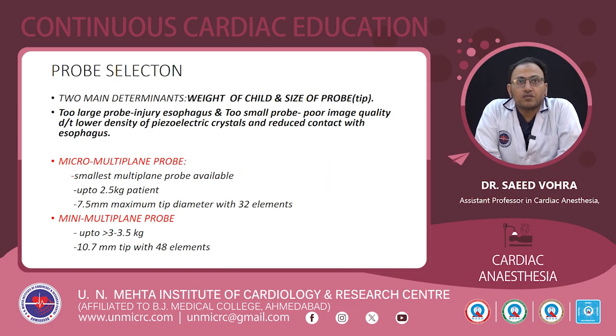Coming to the probe selection, there are two main determinants while selecting the probe: the weight of the child and the size of the TE probe, especially the size of the tip. If the probe is too large, it can cause injury, esophagitis and oropharyngeal injury. If the probe is too small, then poor image quality can occur due to the lower density of piezoelectric crystals and also due to reduced contact with the esophagus.